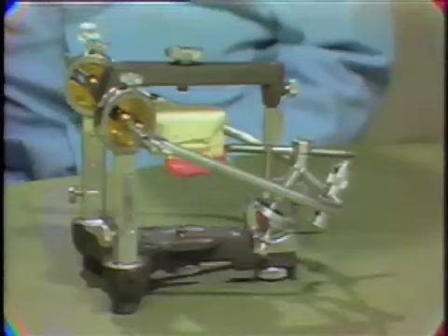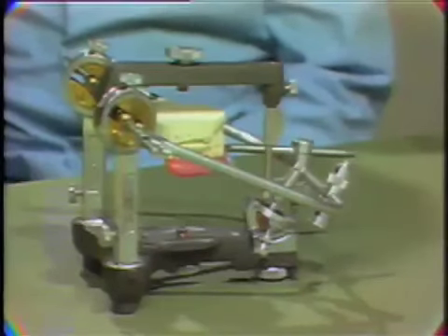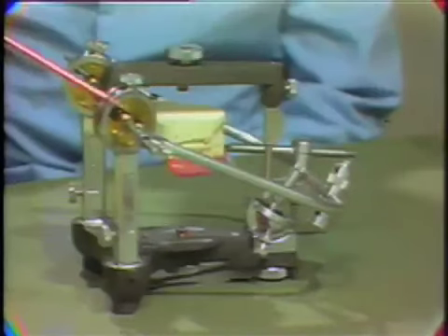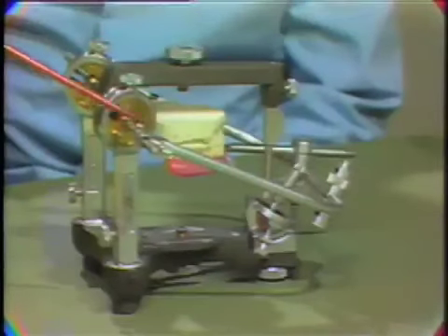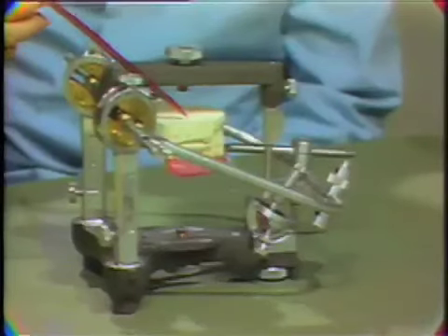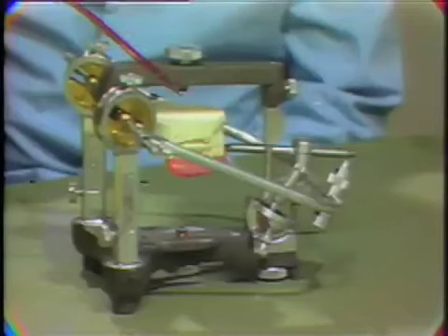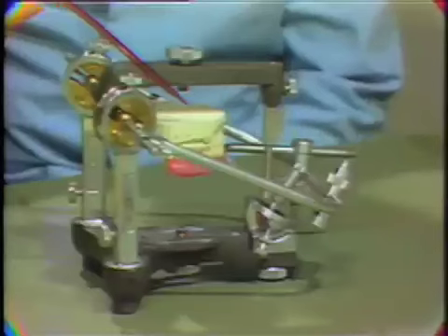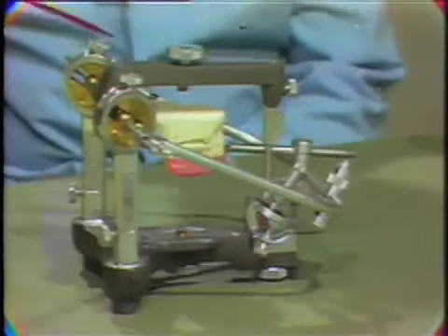The facebow is used to orient the maxillary cast in relationship to the terminal hinge axis. We would have the facebow attached to the articulator, centered over the axis of the articulator, and we have our maxillary cast in our bite fork registration, so that this cast is the same distance from the axis on the articulator as it was in the head. We now need to then mount the maxillary cast to the upper member of the articulator.